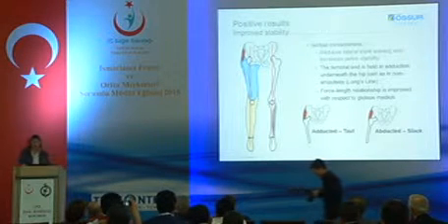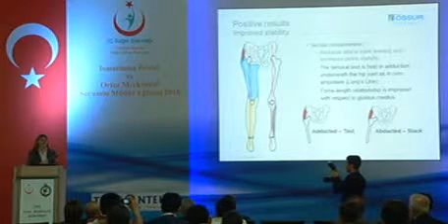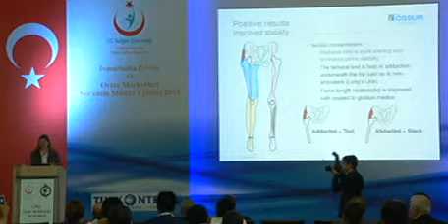Yeah, so apart from once we improve the stability of the patient, we also start to improve the control of the prosthesis. So now it starts to make sense to put very good components under there to get the most out of those components.